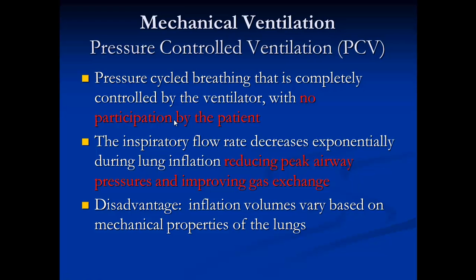Pressure control is completely controlled by the ventilator. This is when the patients are really, really sick, critically ill, that you have exhausted all the parameters for assist control. No participation by the patient whatsoever, so this patient must be highly sedated with a Ramsay greater than 3 and sometimes paralyzed with Nimbex.